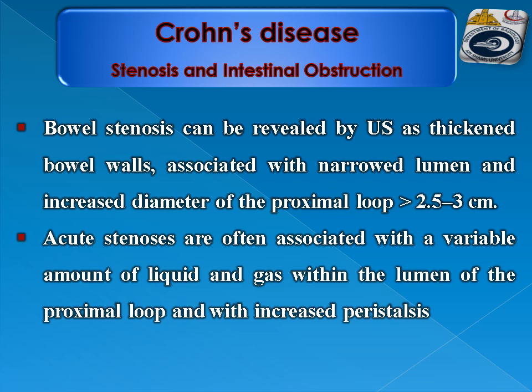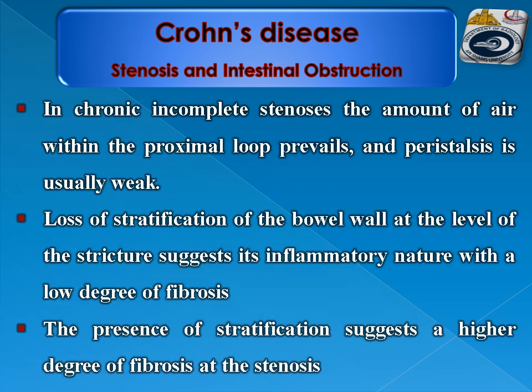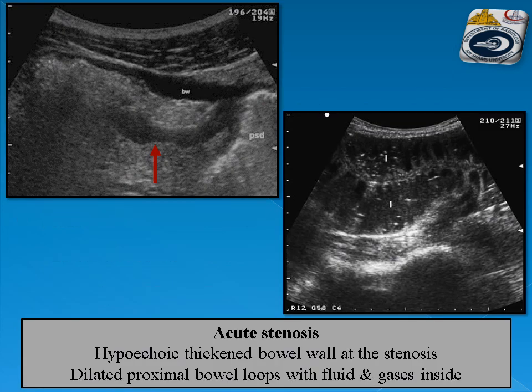Bowel stenosis can be revealed by ultrasound as thickened bowel wall associated with narrowed lumen and increased diameter of the proximal loops to more than 2.5–3 cm. Acute stenoses are often associated with a variable amount of liquid and debris within the lumen of proximal loops and with increased peristalsis. An example shows a hypoechoic strictured bowel segment with proximal dilatation of bowel loops containing air and fluid, with the hypoechoic nature denoting inflammatory nature with less degree of fibrosis.